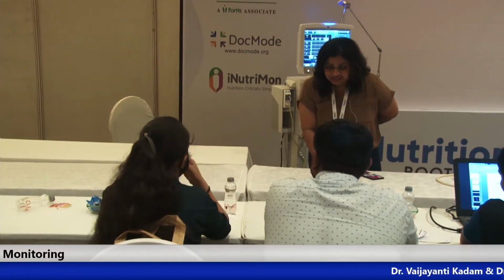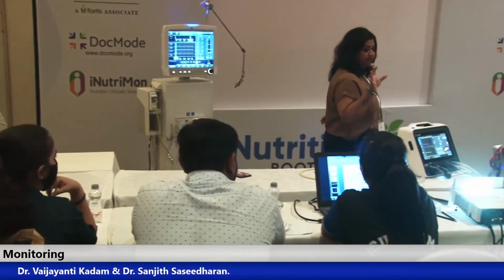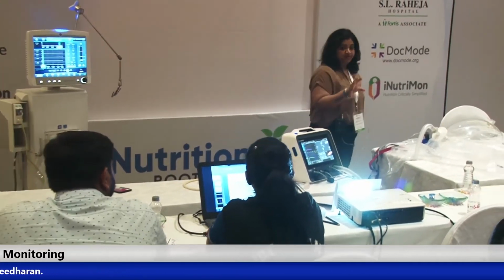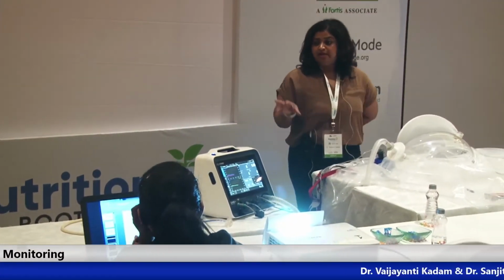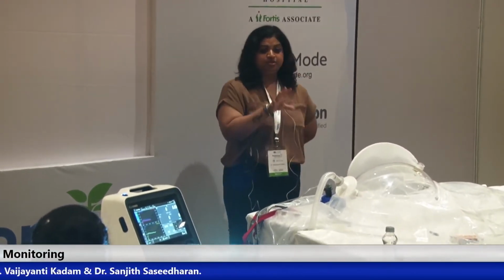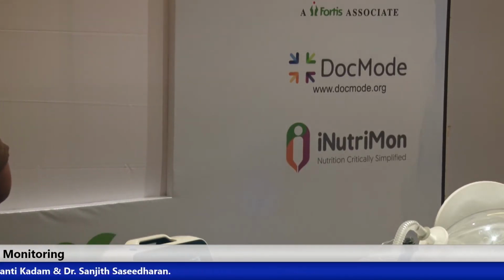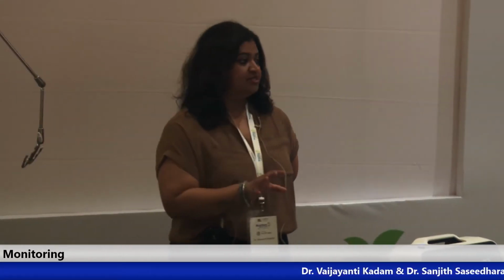Yes. That's why I'm coming to it. So ideally, as per the Society of Critical Care Medicine, as well as ASPEN, the American Society of Enteral and Parenteral Nutrition, as per their guidelines, if we want to provision our patient with nutrition and assess the nutritional requirements, the gold standard method of understanding energy expenditure is indirect calorimetry. It's not me who's saying that, it is ESPEN, ASPEN, and SCCM that also state this is the gold standard to understand the caloric requirement of a patient.